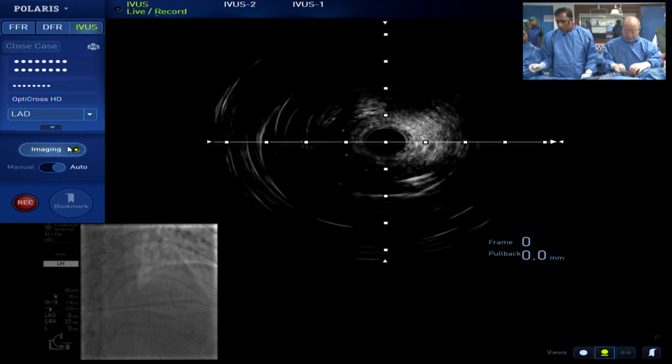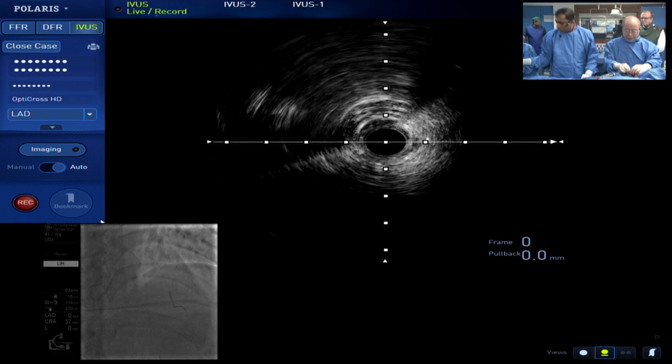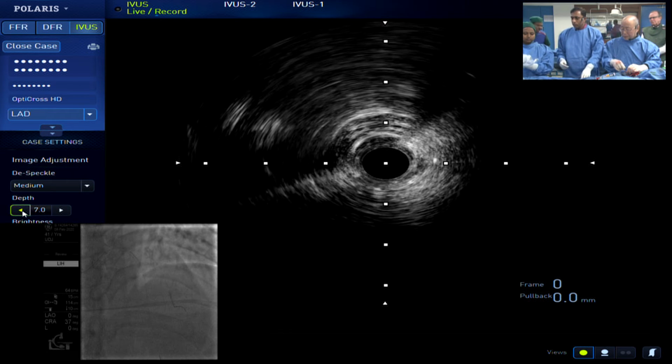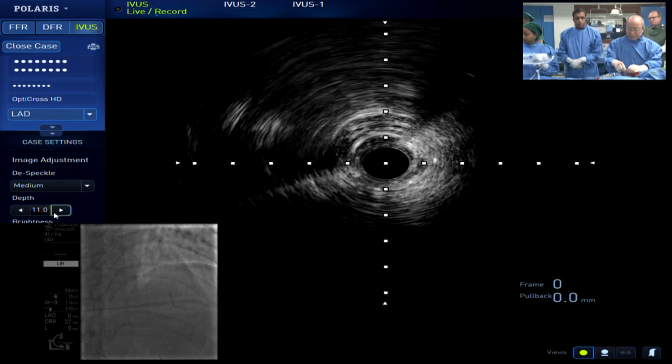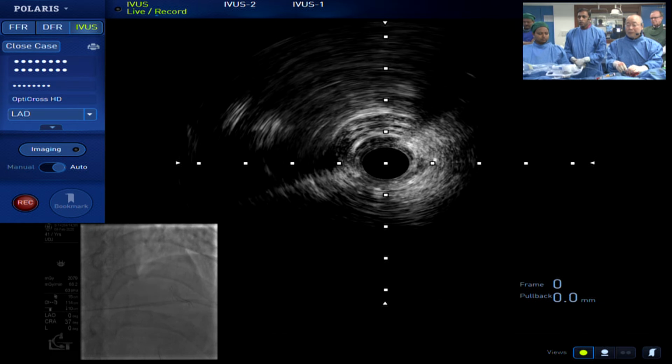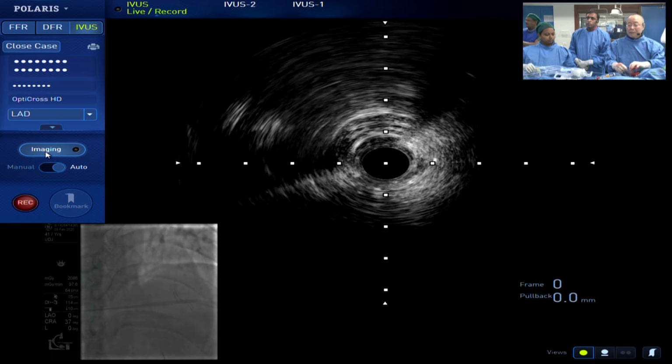Saito sensei, it is only the Japanese registry based on OCT. Statistically, there is no significant difference at the moment because of the small number. That is the reason why Dr. Shite wants to have a much bigger registry, up to 600, to demonstrate the difference between distal cell selection and proximal cell selection.